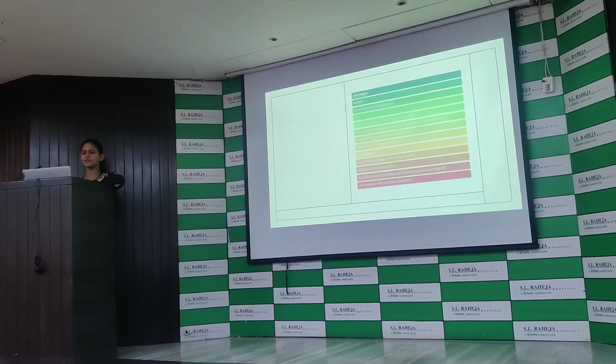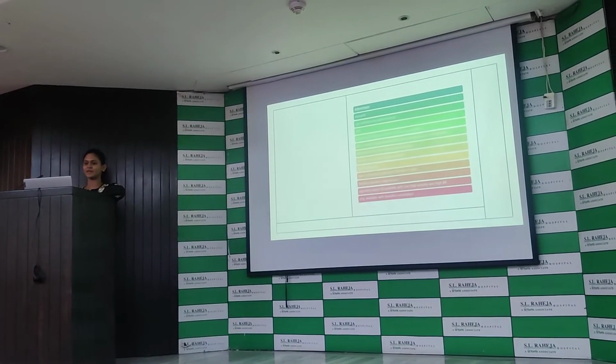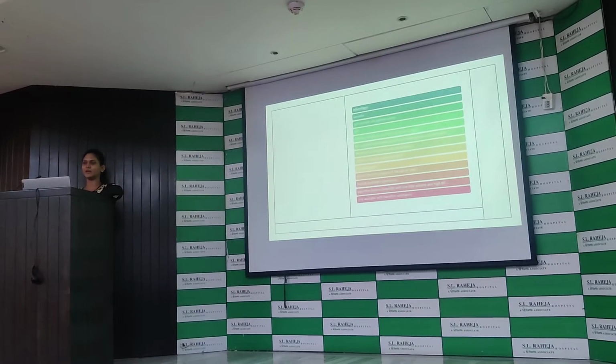The disadvantages are that you cannot directly program the tidal volume, respiratory rate and I:E ratio. There is limited pediatric experience. The algorithm tends to ventilate with low tidal volume and high respiratory rate. It is only available in the Hamilton ventilator.